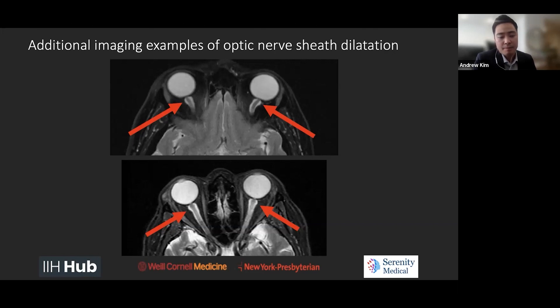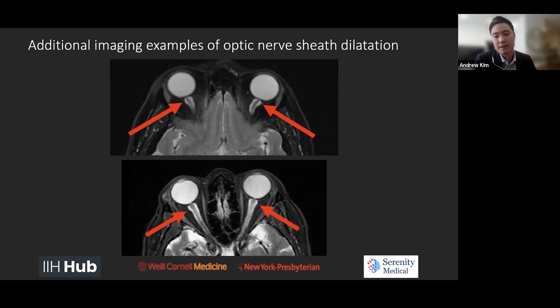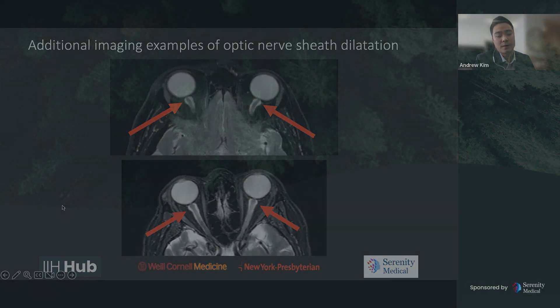Practically speaking, a lot of times we'll call this qualitatively. But just to give you an idea, a lot of the papers out there mark five to six millimeters in diameter as the upper limits of normal threshold for optic nerve sheaths — so just keep that in mind.